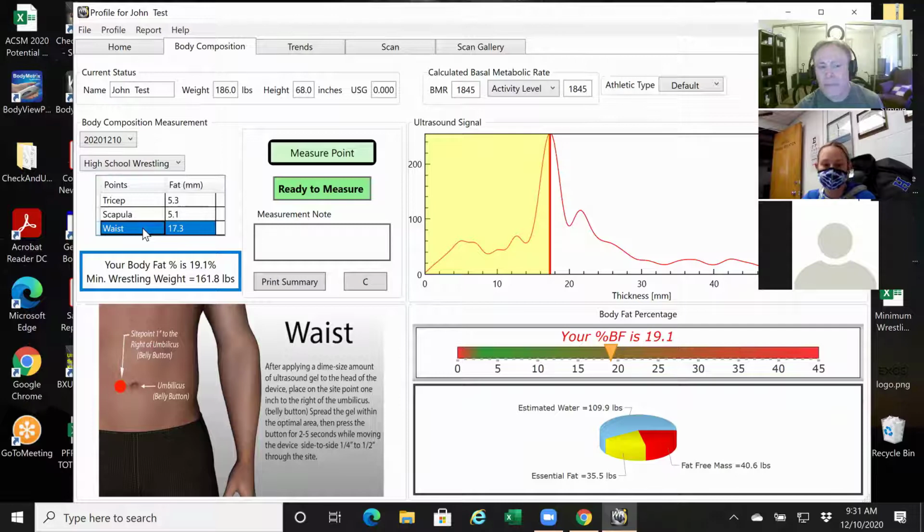So same kind of thing here, really. We look at this graph and we do see some smaller peaks in here. It's usually the first strong peak, and we see that the software recognizes it. So I'm good to go. I could, in theory, just exit out of this profile now and then open up a new one and start the next athlete. But I want to talk about a couple of different things I think that are going to be really helpful for you moving forward.